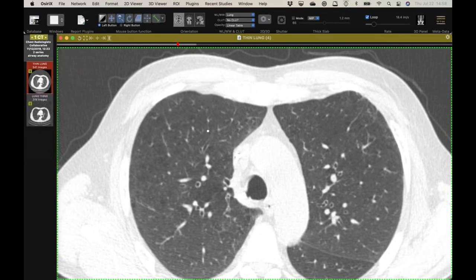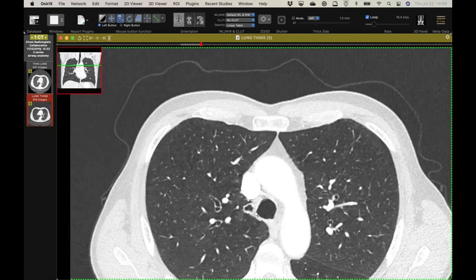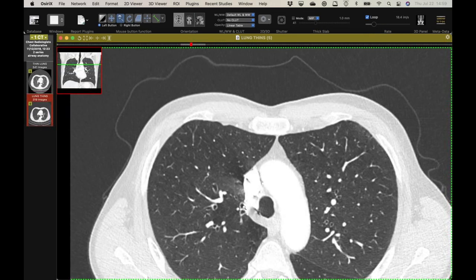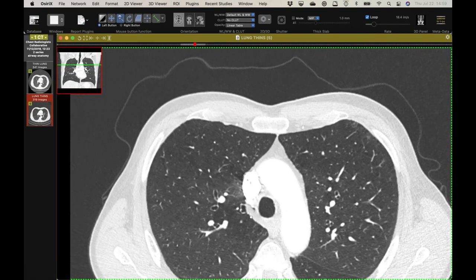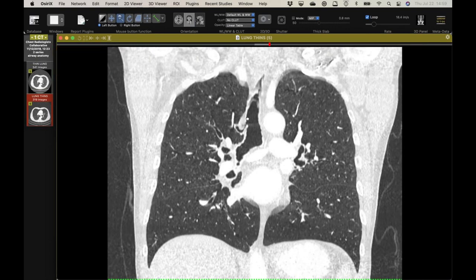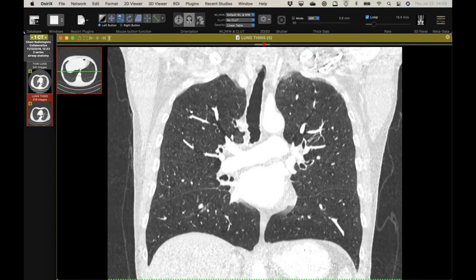So I found an older scan from way back when this looked a little different. You can see, indeed, it is a tracheal bronchus. It just somehow has closed itself off, whether it's dynamic during inspiration or if there's just some inflammation that occurred there. But given that there was persistent mucus plugging on the follow-up ones, I think it's just chronically obstructed. I've seen this type of tracheal bronchus. It comes off right at the azygos, and it tends to dip underneath it and sort of form a little hook, so it often has a very slit-like orifice there. And so I suspect these in particular are prone to retain secretions, infection, and other problems like that.